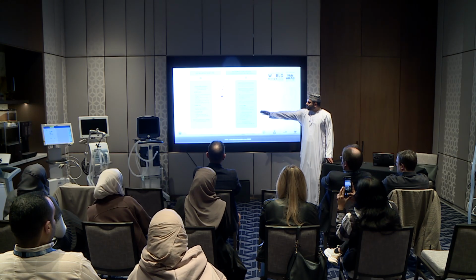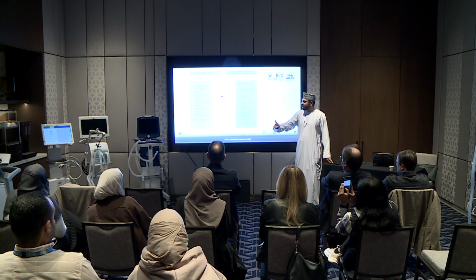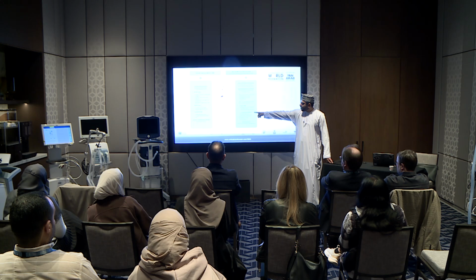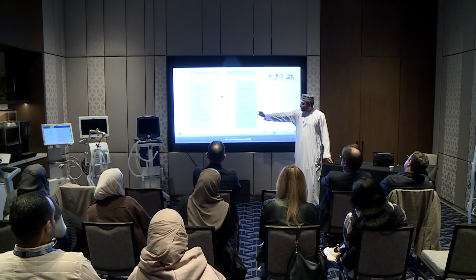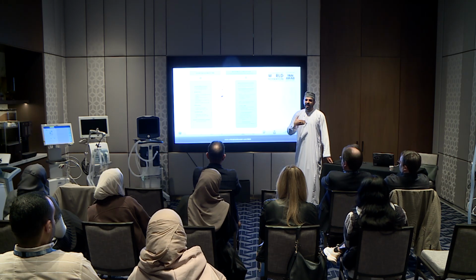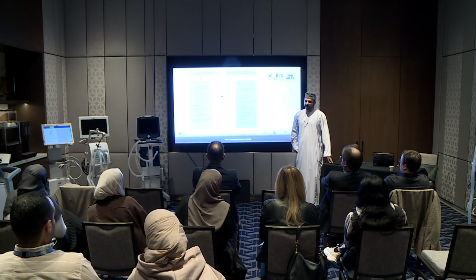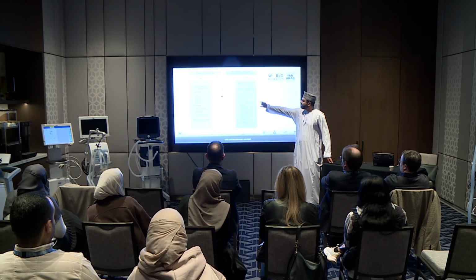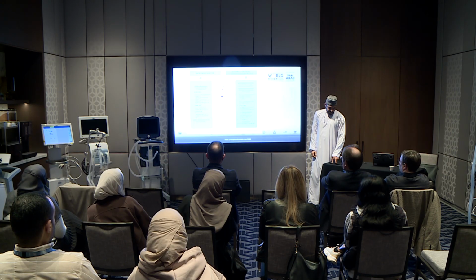On the other hand, one of the standards that is used is esophageal manometry, which will tell you the change in the pleural pressure and the muscular pressure as well, and the diaphragmatic electrical activity. Because we don't have both of those readily in all patients, but we have a ventilator on ventilated patients, it makes sense to find surrogates for inspiratory drive and effort, and the ones that we are going to discuss are the occlusion pressure and the pressure at 100 milliseconds.